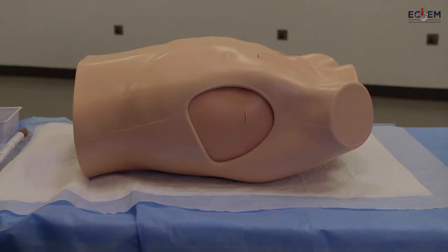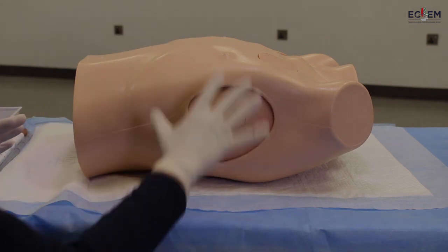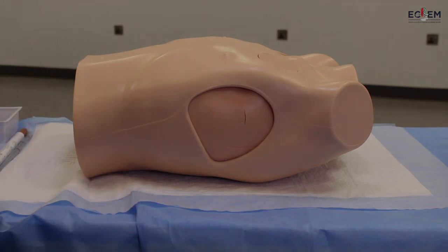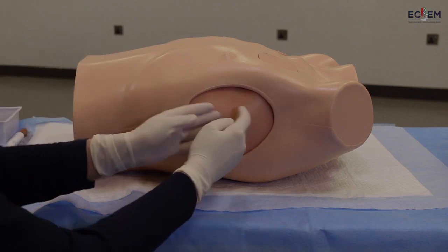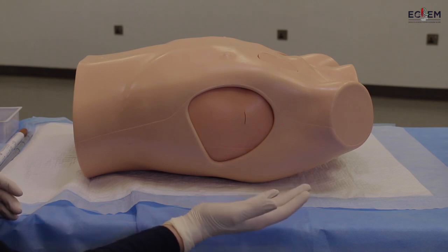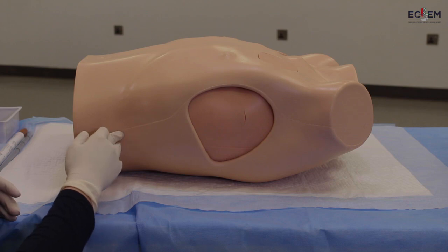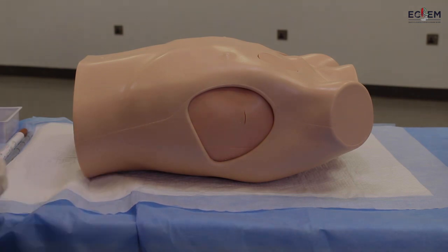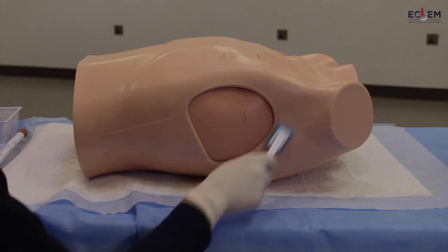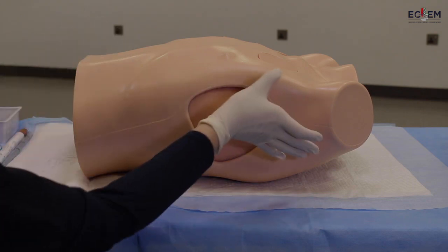Moving on to the procedure: first, position the patient ideally so that the hand of the area where I'm placing the tube is behind the head or upwards, as this opens the intercostal spaces. Also position the head of the bed at 30 to 60 degrees, which pushes the diaphragm downwards. Then sterilize the area as much as possible — my area of interest is the safe triangle.